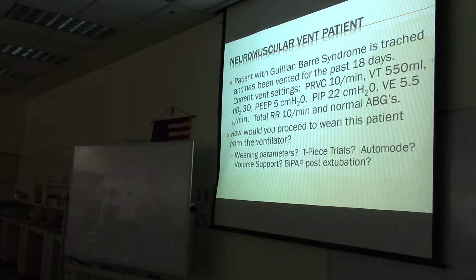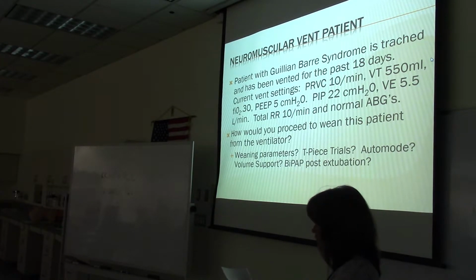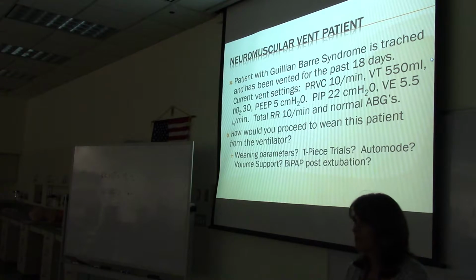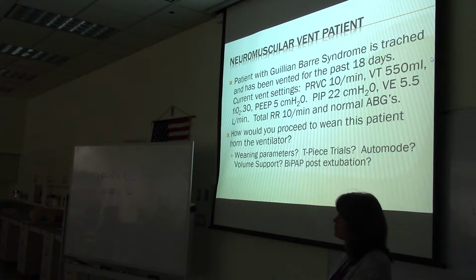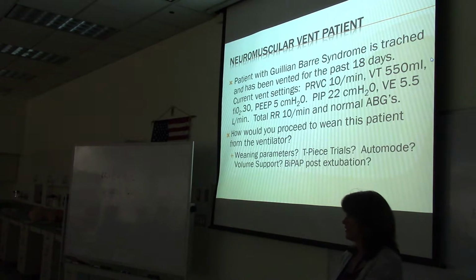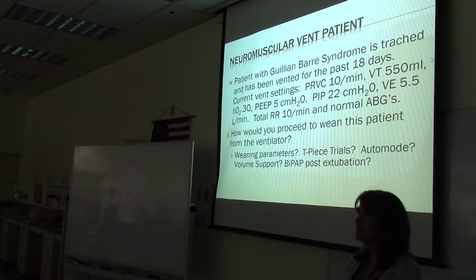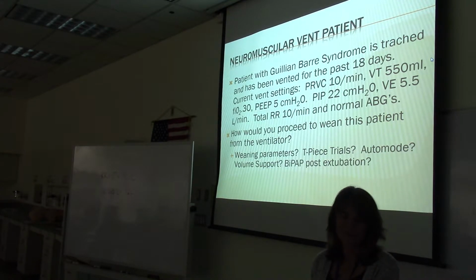What about BiPAP post-extubation? Yes. And then in my notes, I have use a heated humidifier with BiPAP to prevent drying of secretions. Have you seen heated humidifiers used at all? No. With the V60 or with the Vision? Yeah, I don't think I ever see that. It's a great idea, to provide humidification, especially with those fast flow rates that you're giving. But you're right, I don't see it.